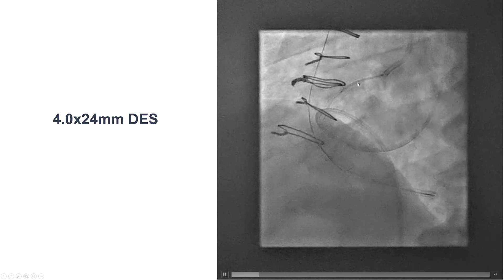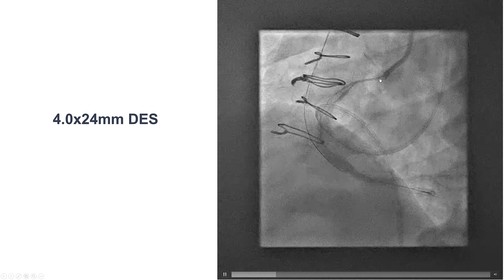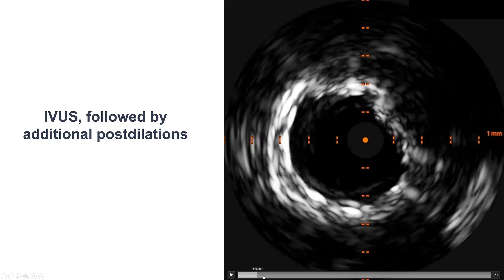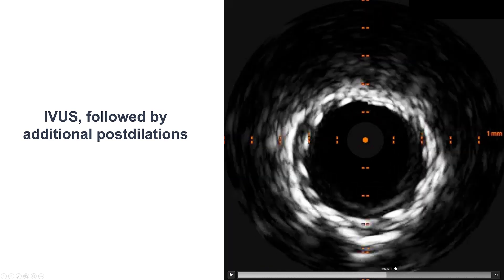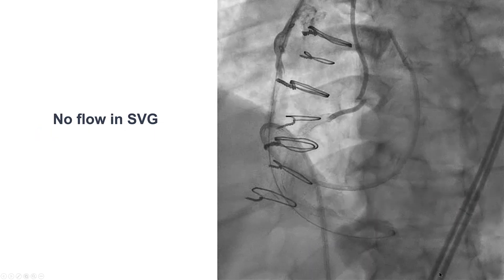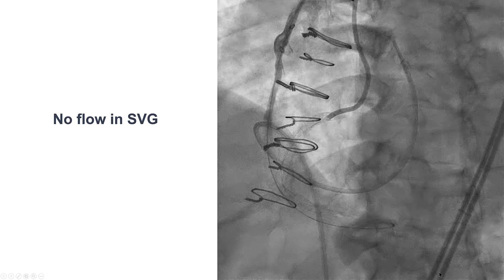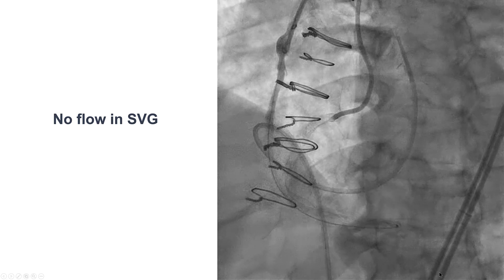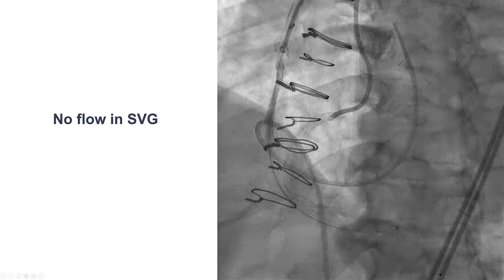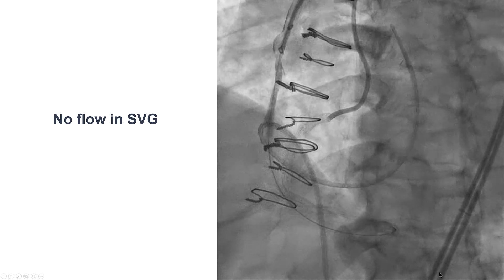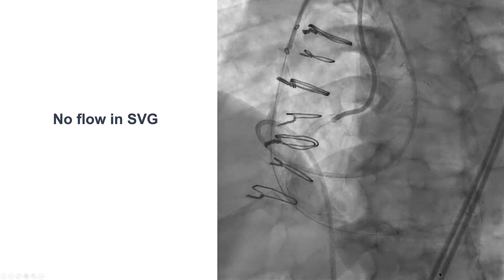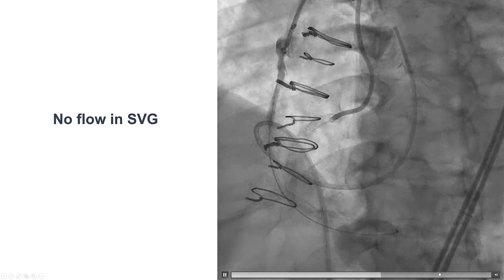We placed additional DES stents from the distal RCA into the proximal right coronary artery, with a final stent all the way to the ostium. We performed intravascular ultrasound to check the result, and there was good stent expansion and stent strut apposition throughout the area of the occlusion. After restoring flow through the native coronary artery, flow into the saphenous vein graft significantly decreased. We debated occluding the saphenous vein graft using coils or an Amplatzer vascular plug, but decided not to because the flow was not very high.